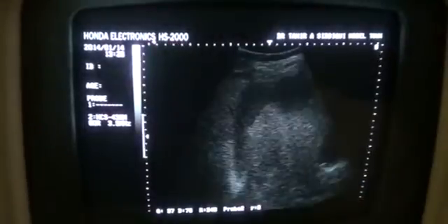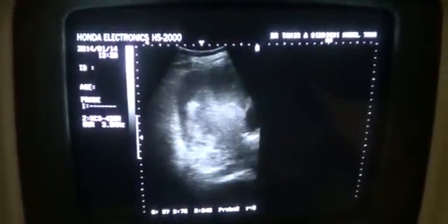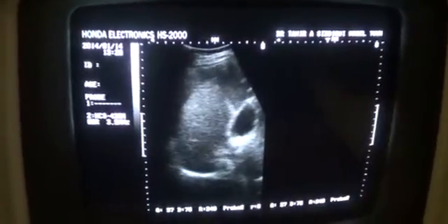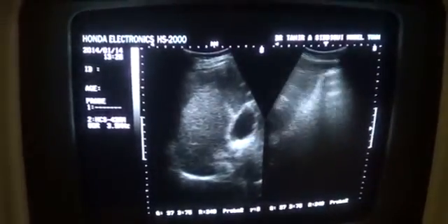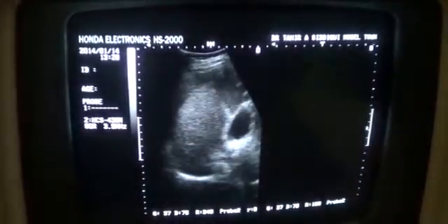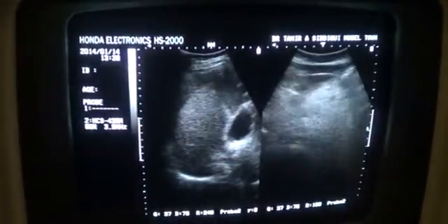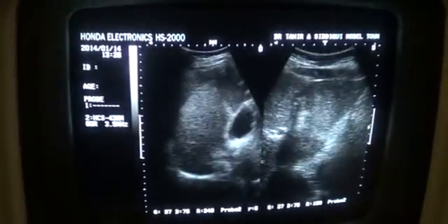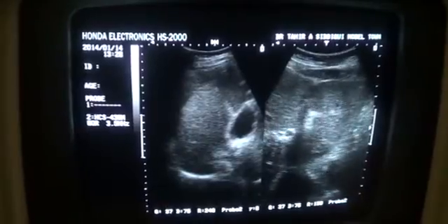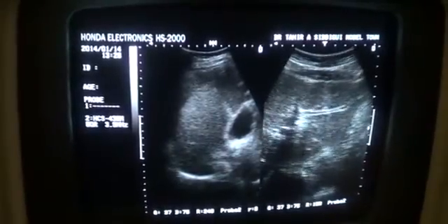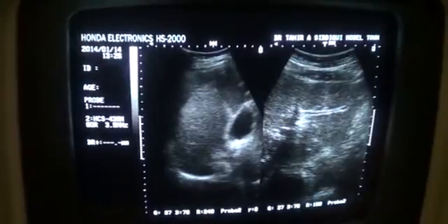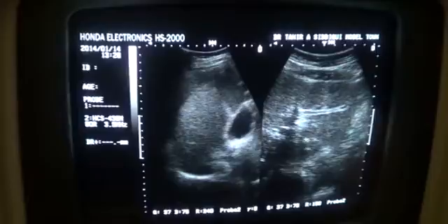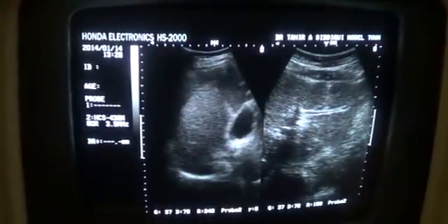This is the right lobe of the liver showing generalized reduced total surface area, with normal dimensions of the left lobe. This is the first section of the left lobe.